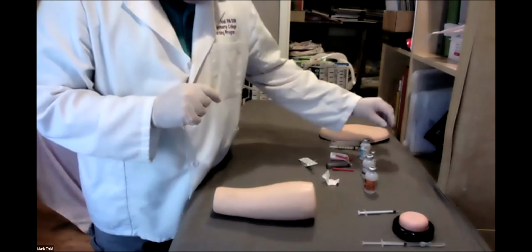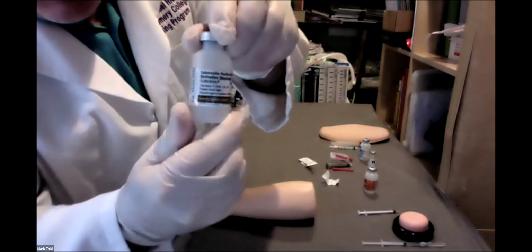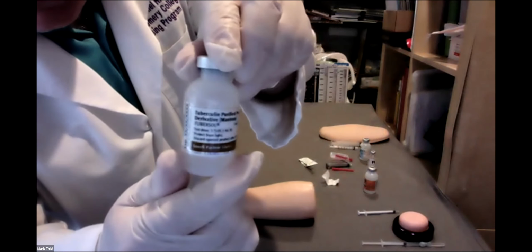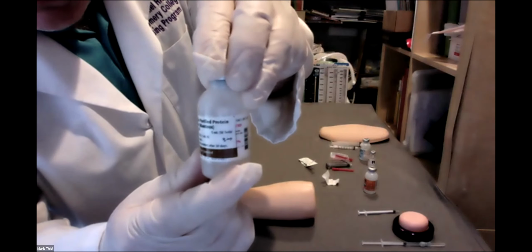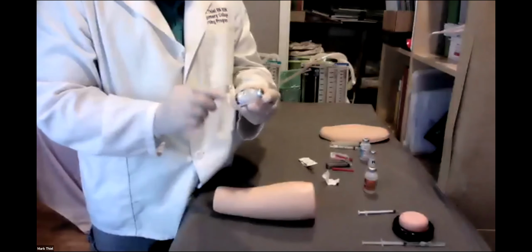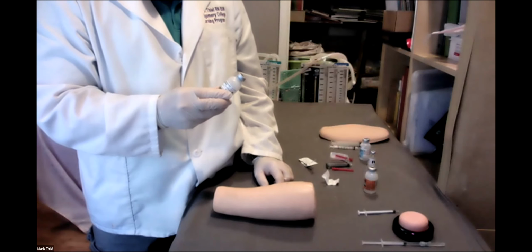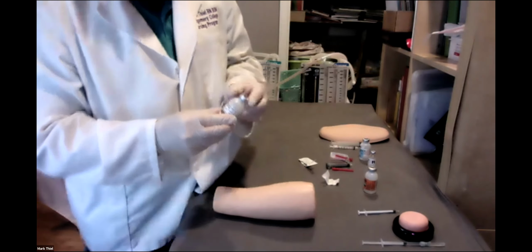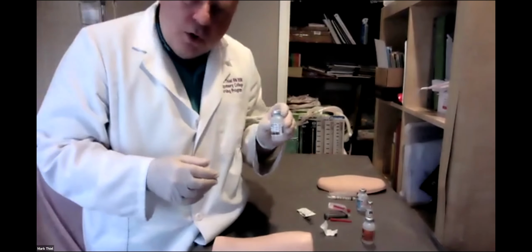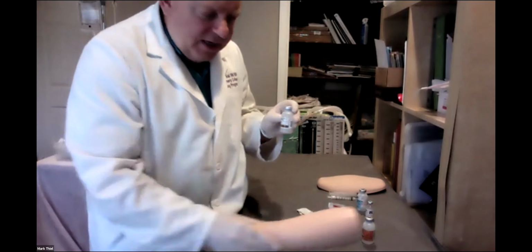What is that? If you see on the label, it says purified protein derivative. If you can see it, I know it's hard to read. Once again, expiration date. In our particular case, and with most companies or hospital protocols, the manufacturer is also documented along with the expiration date. That's distinctive to the ID injection.